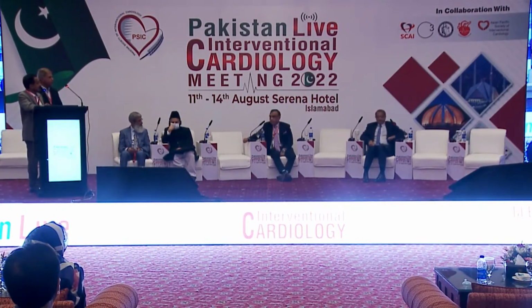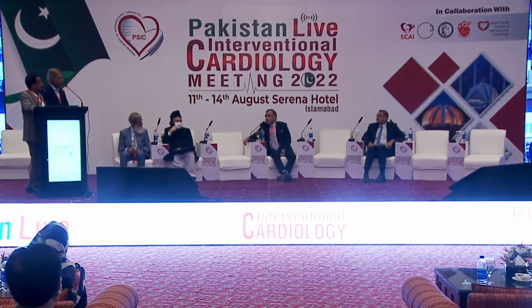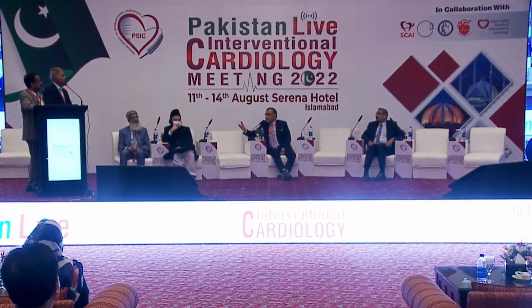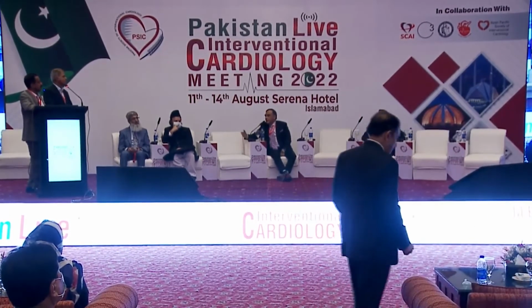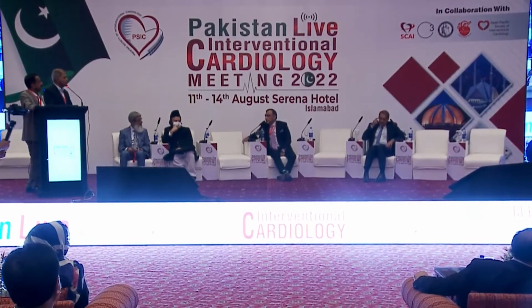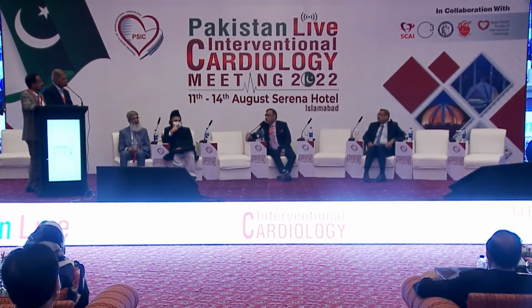Okay, Nadeem, can you? If there's not much mismatch between the left main and the LAD, then I would just go ahead and do a crossover stent, because IVUS is only available in less than 5% of cath labs, so we have to be practical. If there's a lot of mismatch, let's say a 5 and a 3.5, then I try to nail it. And when I nail it, I would use a balloon within the left main to circumflex at low pressure, just to make sure that the stent doesn't protrude into the left main.